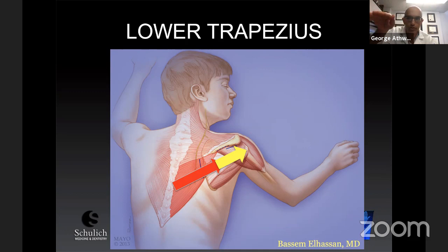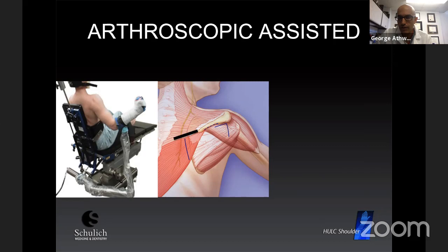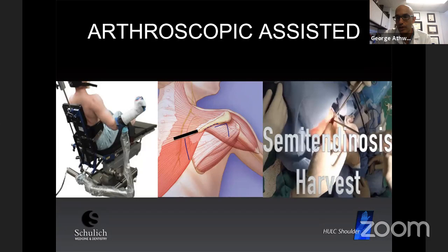With the arthroscopic assisted technique, I place my patients into beach chair. I make a horizontal incision rather than a vertical incision, as you can see here in the dark black. And then I harvest a semitendinosus from the ipsilateral knee at the same time.